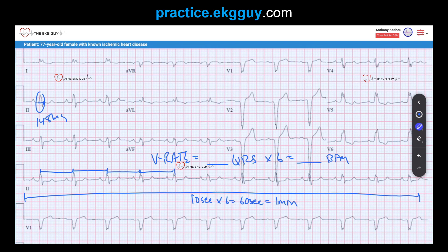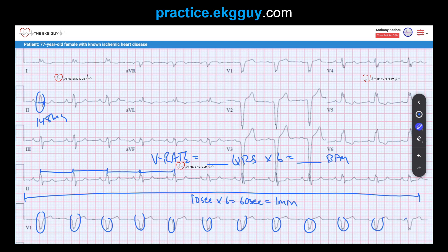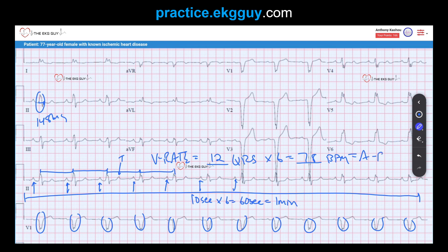Looking at the atrial rate, we notice there's a P-wave for every QRS complex. Note that the T-wave should not be confused with a P-wave. These are all P-waves preceding each QRS complex. The ventricular rate is 70 beats per minute and so should the atrial rate. We have a normal atrial ventricular rate.